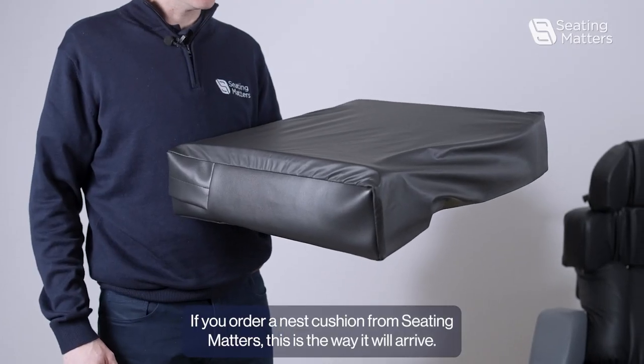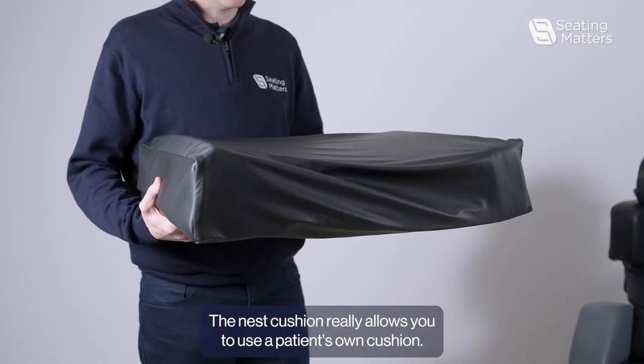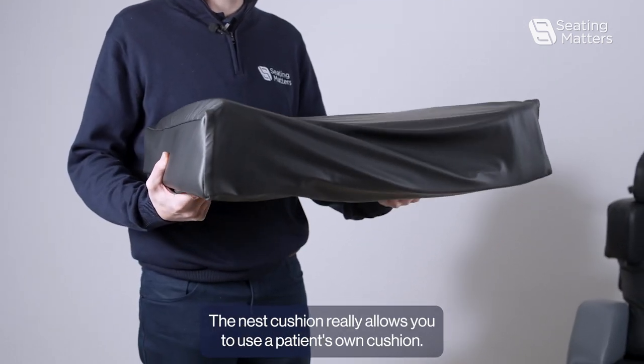If you order a Nest Cushion from Seating Matters, this is the way it will arrive. A Nest Cushion really allows you to use a patient's own cushion.